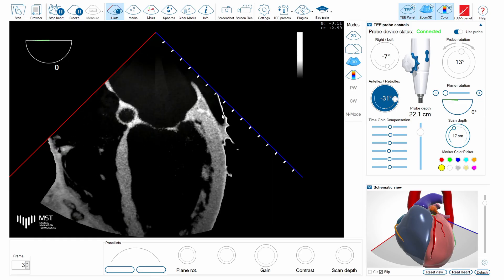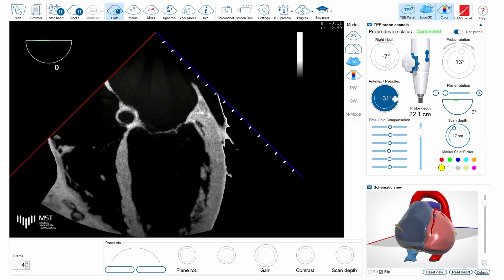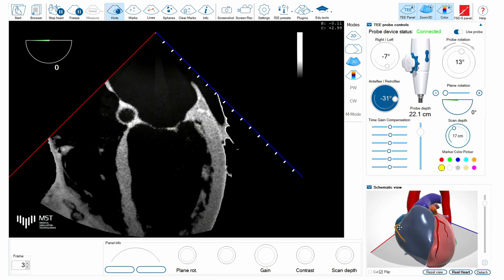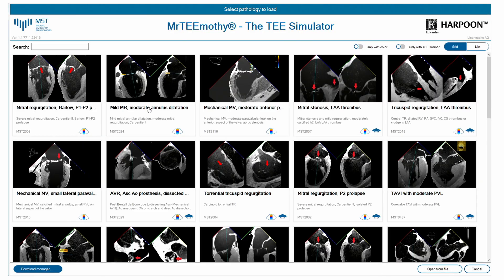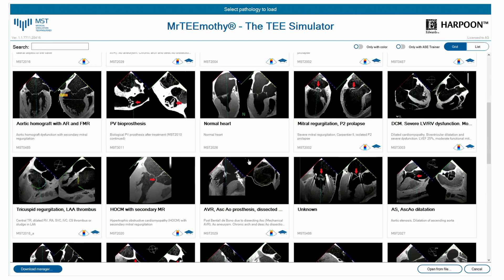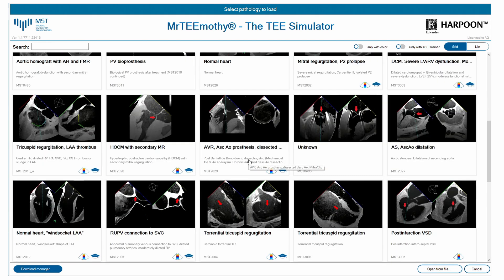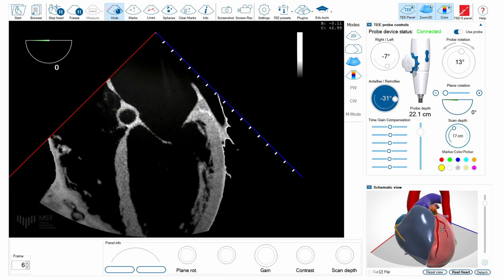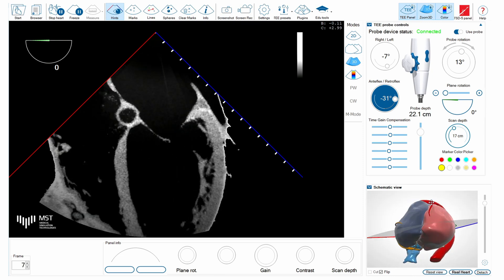Here is the screen of the simulator with the model which is individual for each patient. As you can see, we have a plenty of different pathologies here, and for each pathology we have an individual 3D model that you can see on this right-hand side panel.